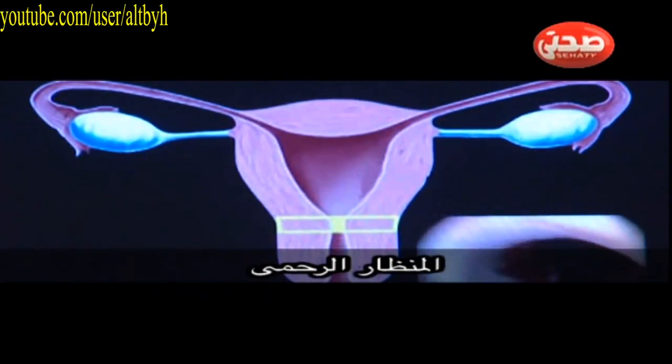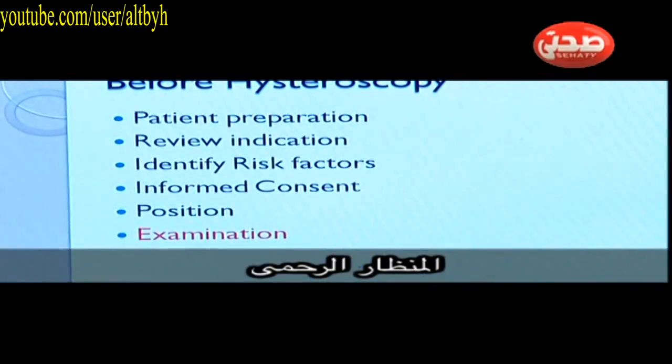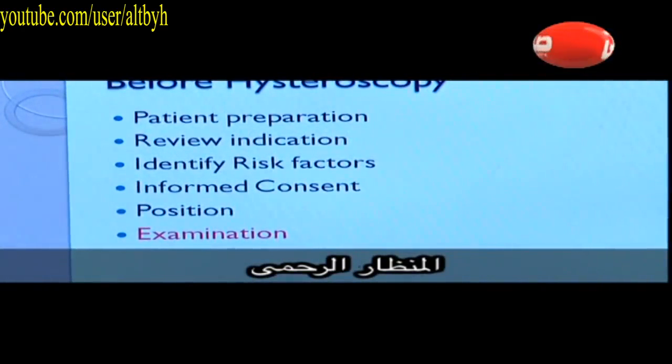Okay. It's very important before the hysteroscopy to consider the very important items. Patient preparation is very, very important, and being aware of the patient history is of paramount importance. We have to review the indication of the hysteroscopy and make sure it's needed, and identify the risk factors of the patient, and make sure that you are aware of the previous surgeries of the patient or any risk factors like high BMI or previous scars in the uterus, which is very, very important.